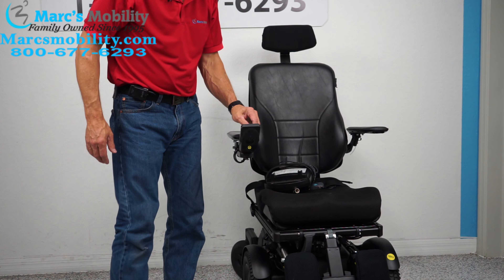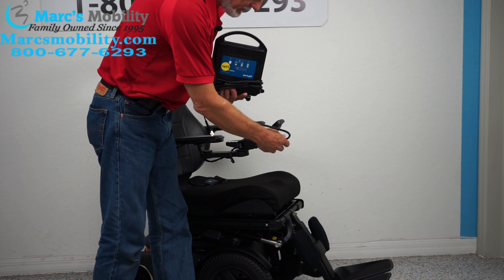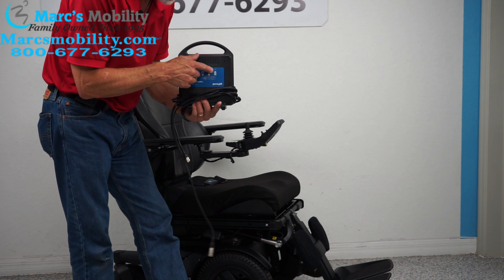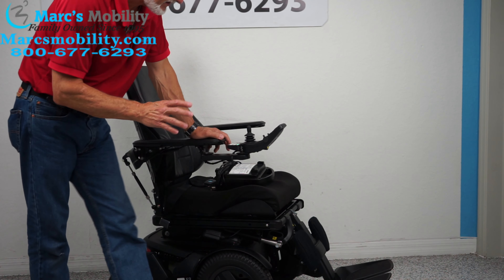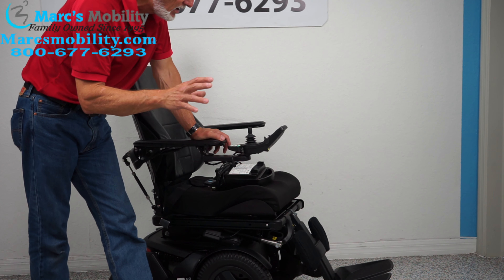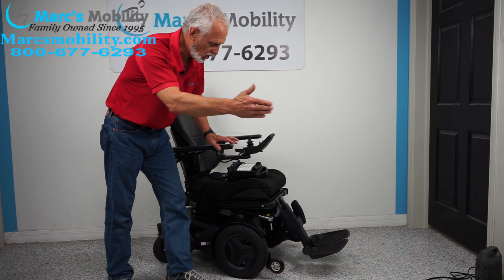When you charge the batteries in this chair, you take your charger and plug it right below the joystick. As soon as the third light is fully green, the charger will stop charging. This chair has a total distance of about 15 miles on one battery charge in perfect condition. If you're going fast or going uphill outside, you won't get 15 miles, but you'll get a long ways.